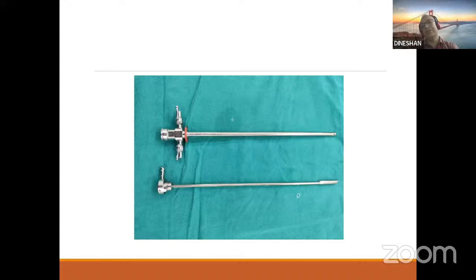To prevent that, you can always use a 17 French sheath, or you have to use a Nickel adapter, or you can use some other instruments where the tip is rounded.